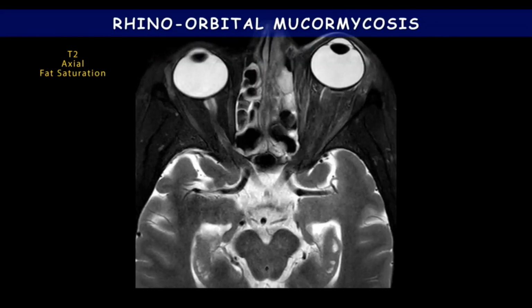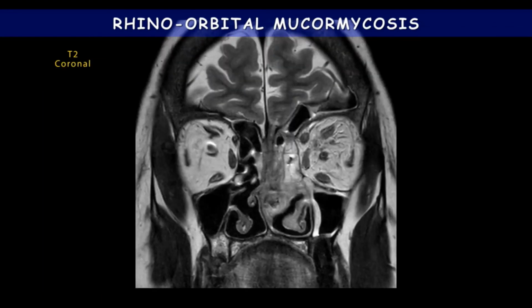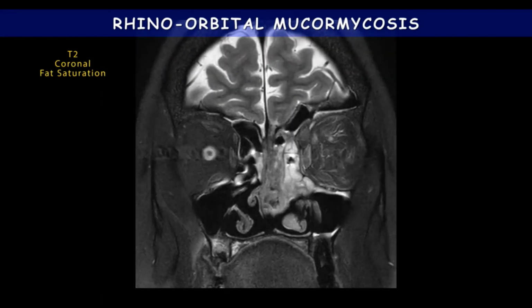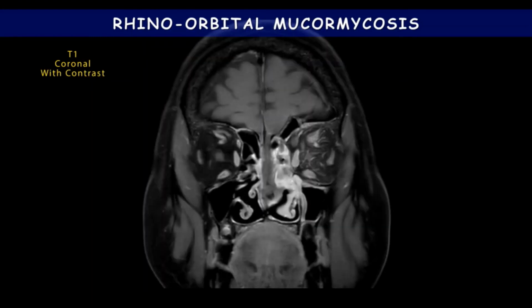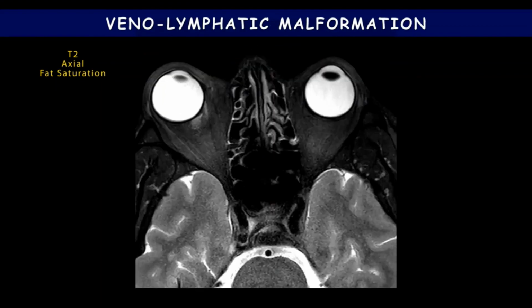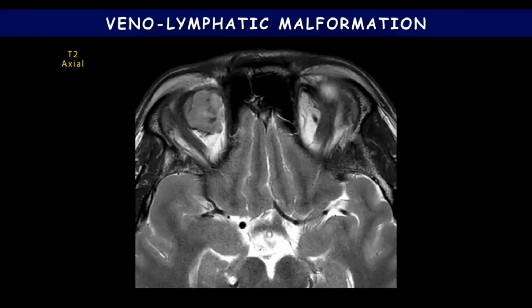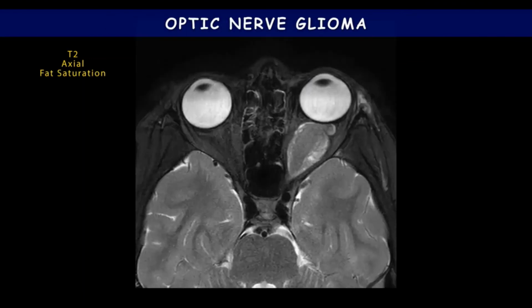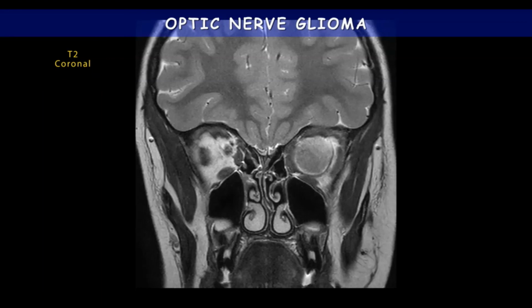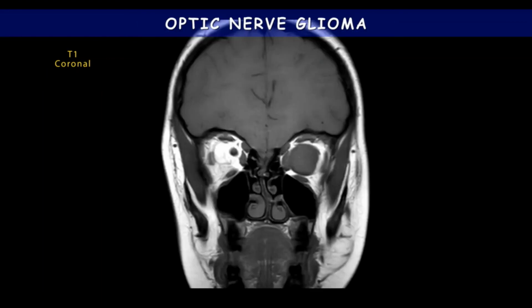MRI provides ophthalmologists with qualitative and quantitative information of various pathologies. Evolution is the secret for the next step, and a comprehensive understanding of MRI analysis makes the ophthalmologists independent and aids in clinico-radiological correlation preoperatively and intraoperatively. A prompt postoperative histopathological correlation adds to our continued learning and understanding of the different pathologies and promotes transformation into better meticulous surgeons, because every success story is a tale of constant adaptation, revision, and change.